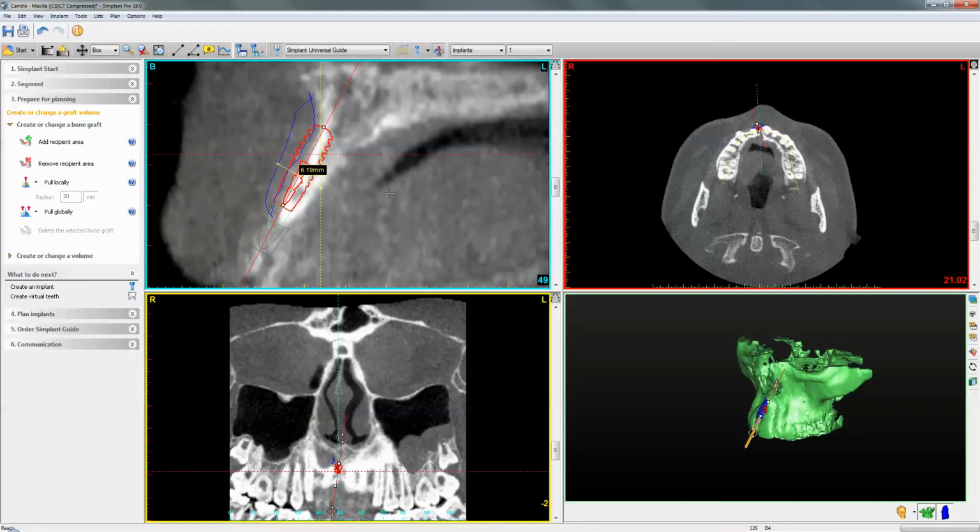Now, I'm not quite sure what sort of grafting materials you use, but we do have some very new grafting materials that we offer called the O6 range, particularly the O6 Plus, O6 Volumax, and O6 Bone. Just to give you a brief introduction, O6 Bone is a 2-in-1 membrane-like graft, also known as a grafting material. It's quite large, but it comes in 3 sizes.